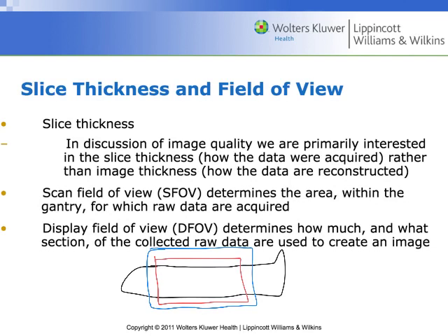And I just remembered the other thing I wanted to say on the other slides. Another significant thing for this, right, in terms of how we're planning these things and the bearing that it has on image quality and patient dose is this imaginary point right here called isocenter, right? We want the isocenter as much as possible at the center of the anatomy of interest, right? At the center of the anatomy of interest.